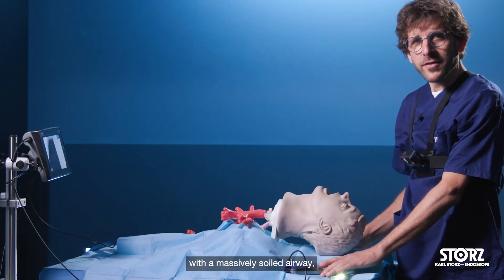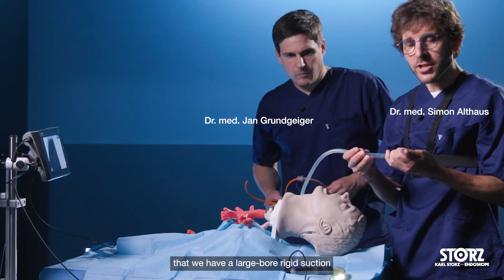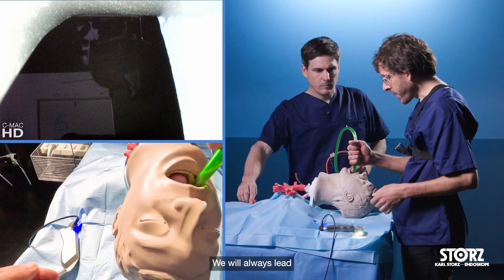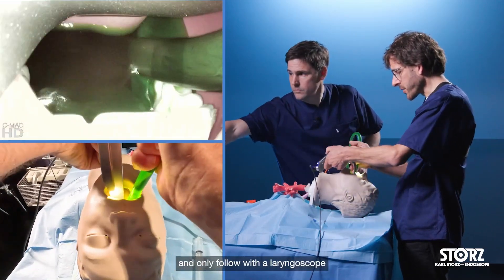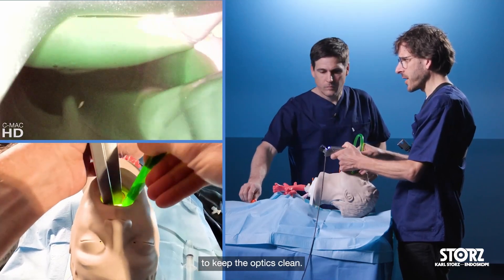If we are faced with a massively soiled airway, it's vital that we have a large-bore rigid suction to lead the path. We will always lead with a suction to clean out the airway and only follow with a laryngoscope as soon as the airway is clean enough to keep the optics clean.